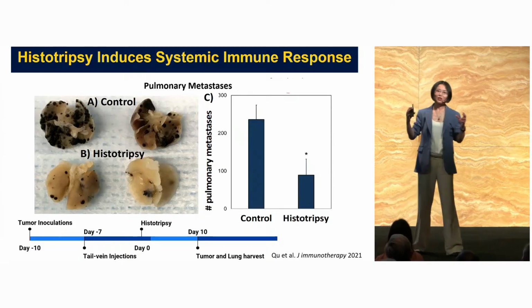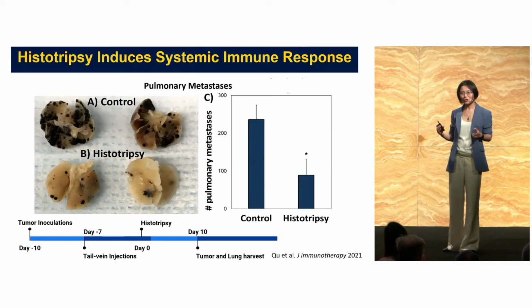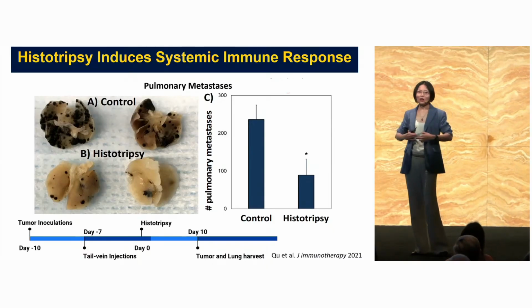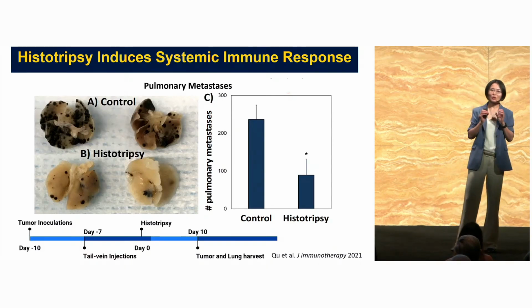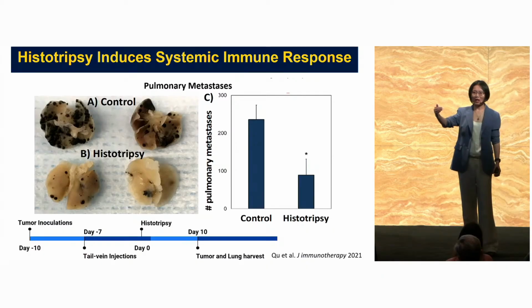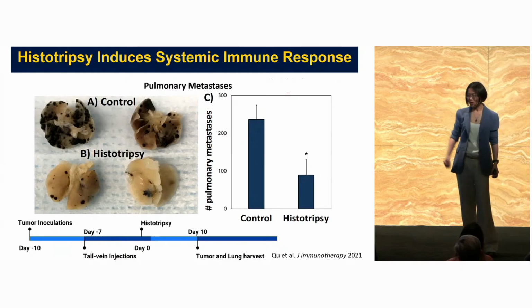And now there's research ongoing, hopefully leading to clinical trials soon, to combine histotripsy with immunotherapy to enhance their effects. There are things we still need to adjust on the histotripsy parameter side to really maximize the immune response, but this will elevate the treatment from just a non-invasive local ablation to a systemic cancer treatment. And that would further increase the impact.